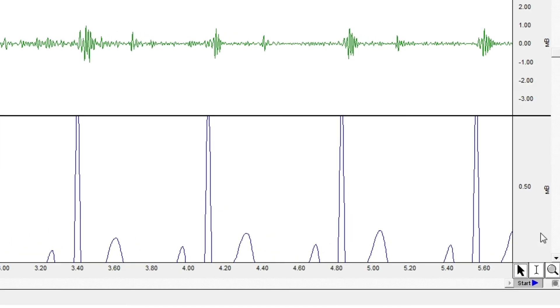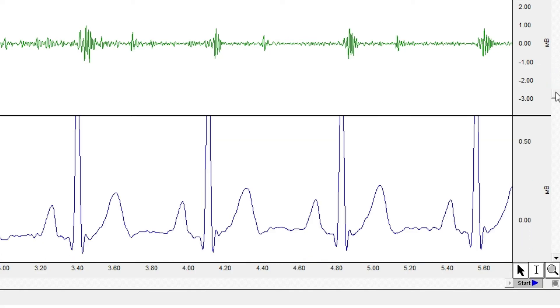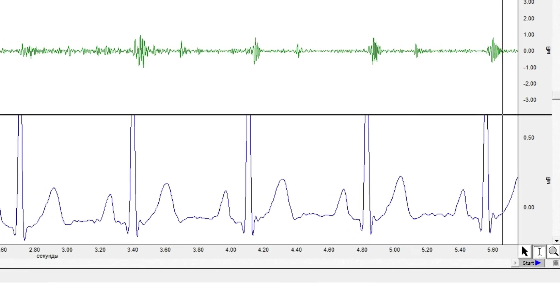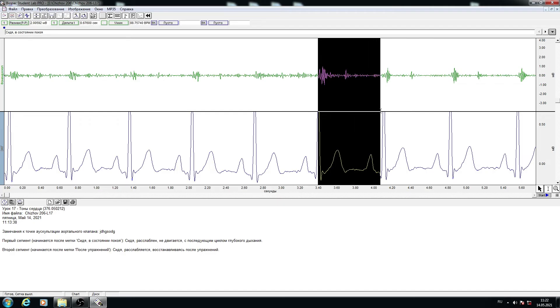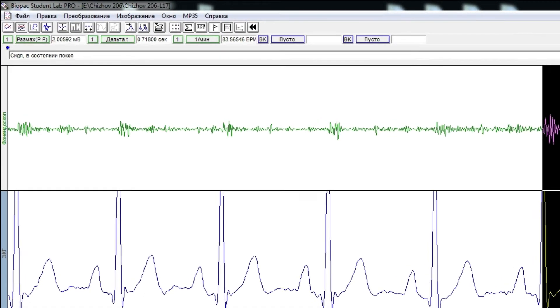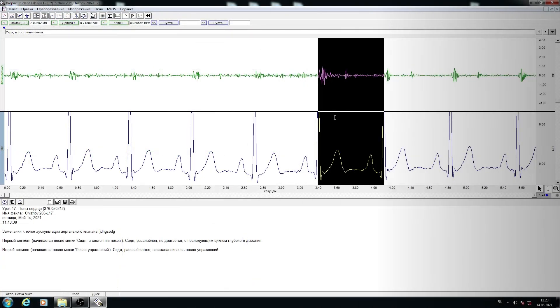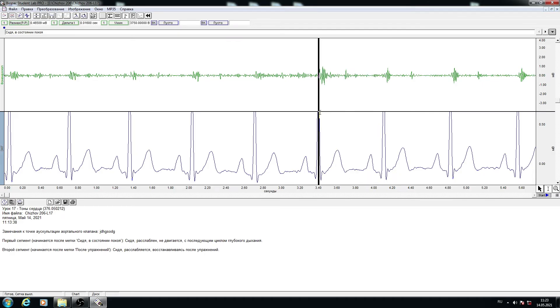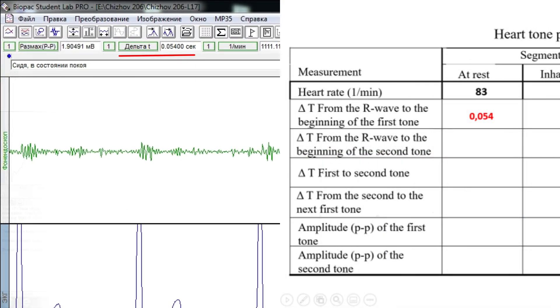Adjust the field for a better view. Using the i-beam cursor, select an area from one R wave to the next and pay attention to the measurement of heart rate. Enter the data in the table. Repeat this process — select an area from one R wave to the next and note the heart rate measurement — and enter the data in the table again.